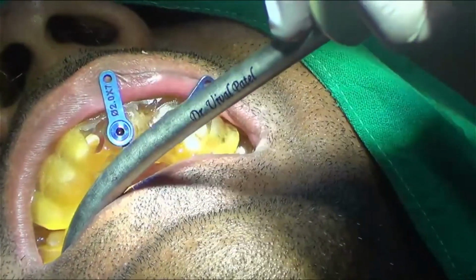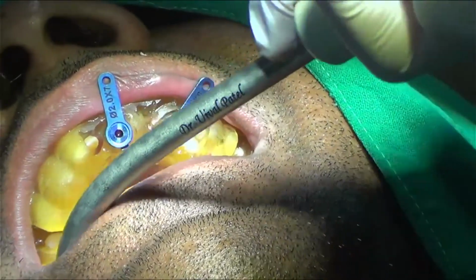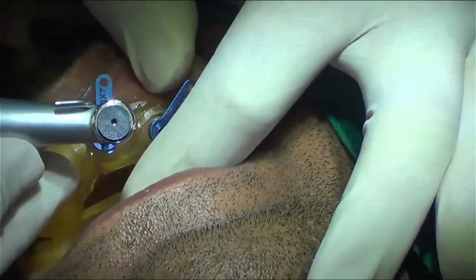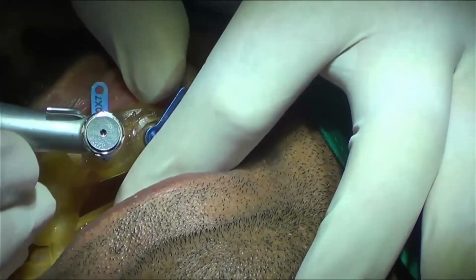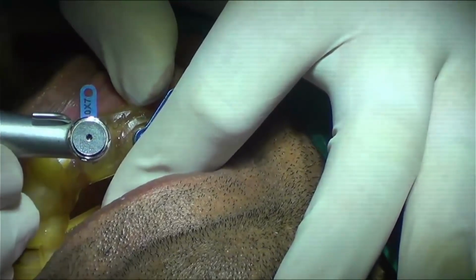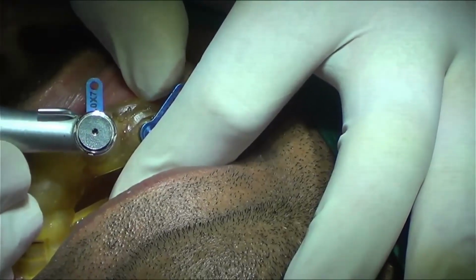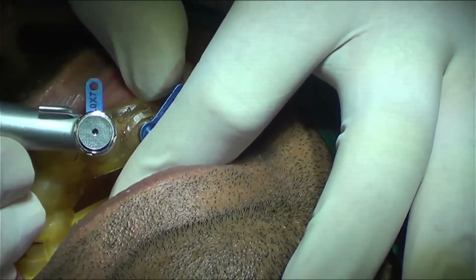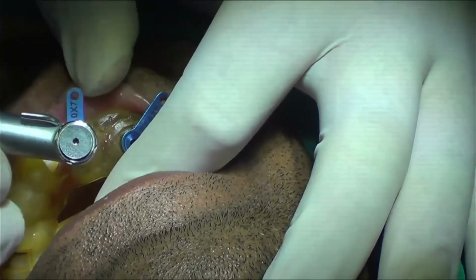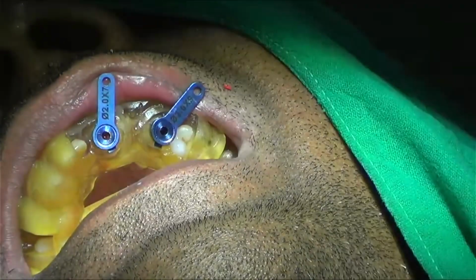Now after 2 into 5, the next drill I will go is 2 into 10. So again I am engaging the previous osteotomy. I have gone into the osteotomy at 100 RPM, and then I am doing the drilling. See, there are no bumping motions. Once I have gone down, I just take my drill out.